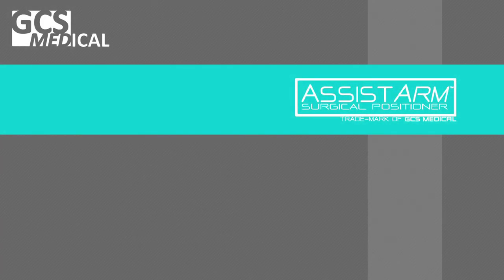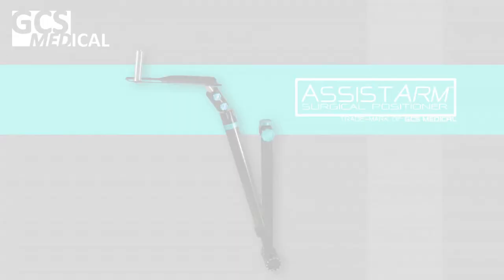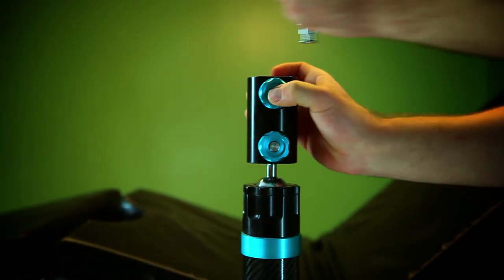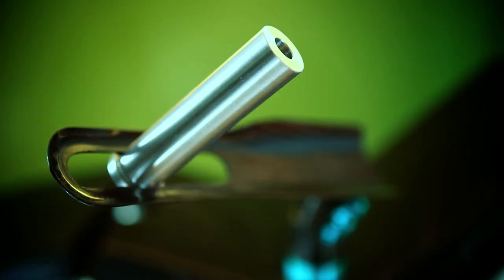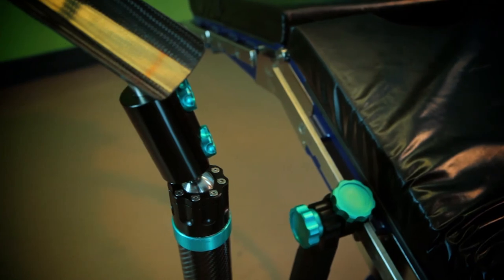GCS Medical's team of engineers and health specialists presents the Assist Arm — a new surgical positioner using innovative materials and advanced design to redefine limb positioning during arthroscopic and open shoulder procedures.